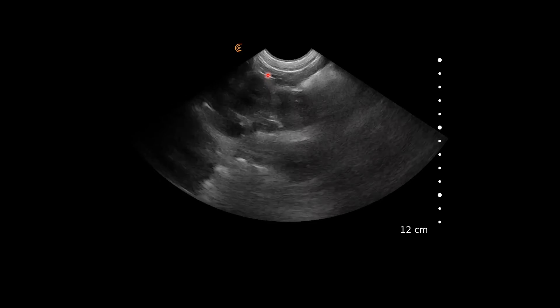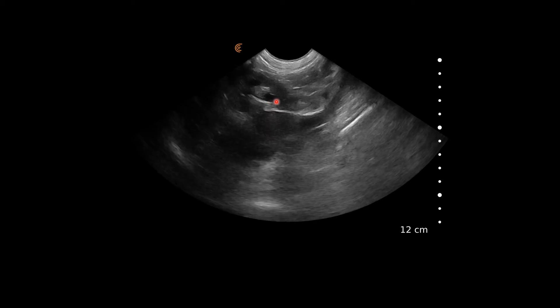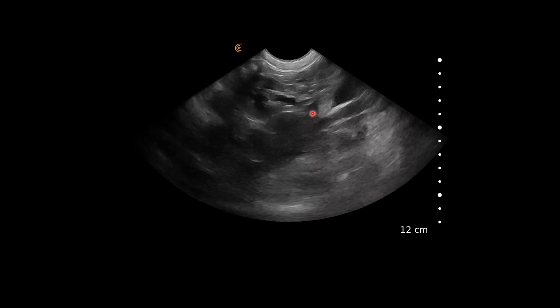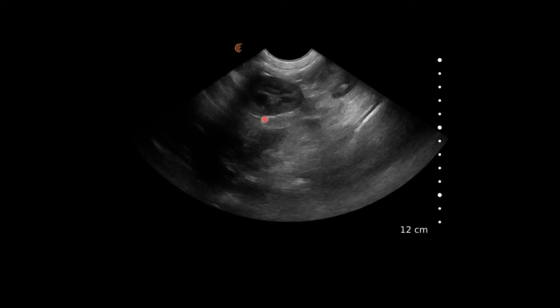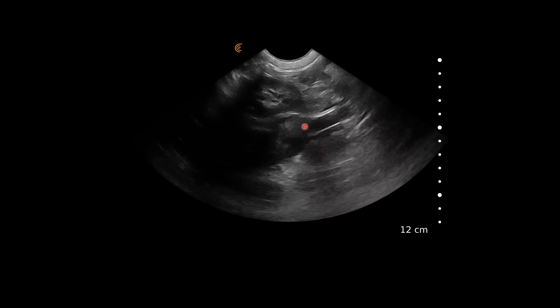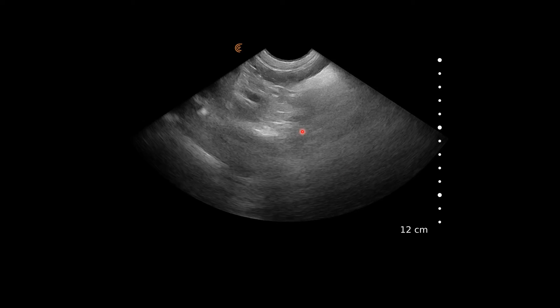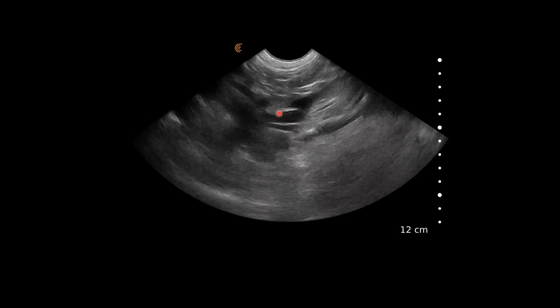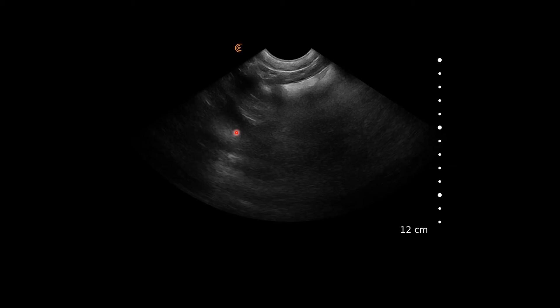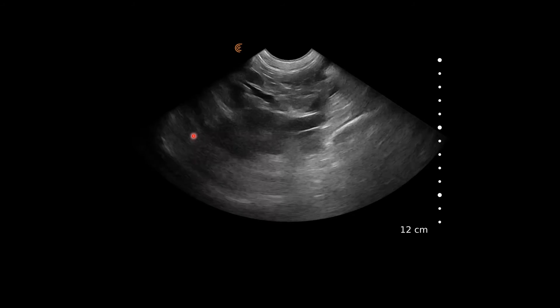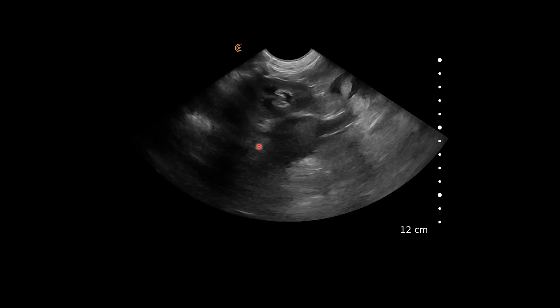Here we have the left kidney, and we can see the renal artery leaving here down to the aorta. This structure here is the left adrenal, which is enormously enlarged. We can see, compared to the size of the kidney, the adrenal gland here is very, very large.